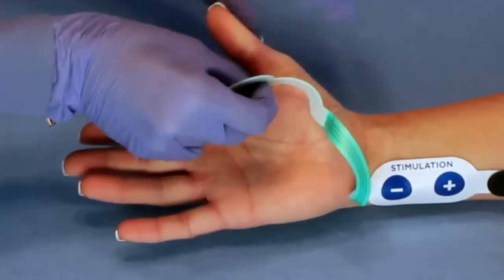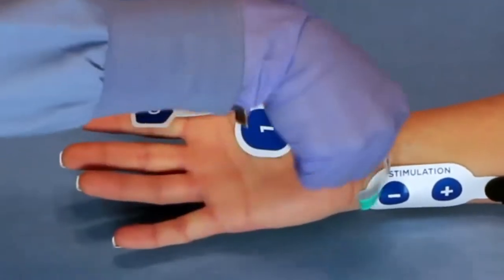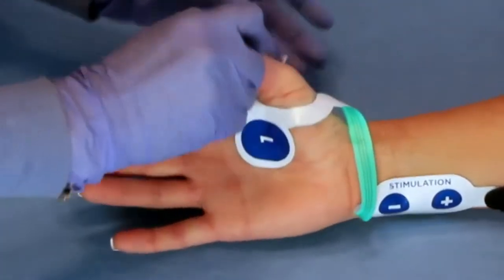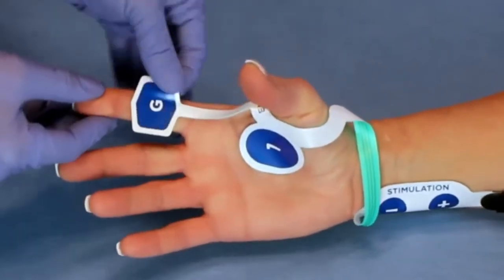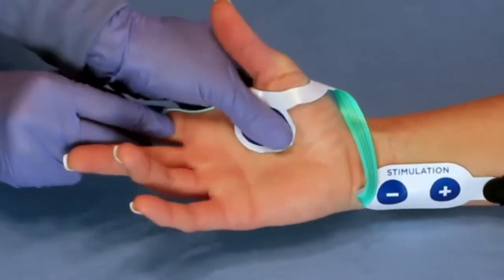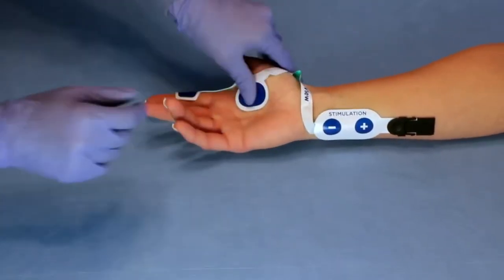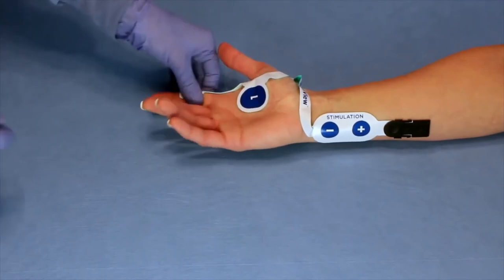Wrap the J-shaped cutout around the patient's thumb and press electrodes one and two over the adductor pollicis and first dorsal interosseous muscles and place the ground electrode on the index finger. Press down firmly on all electrodes to ensure adhesion.